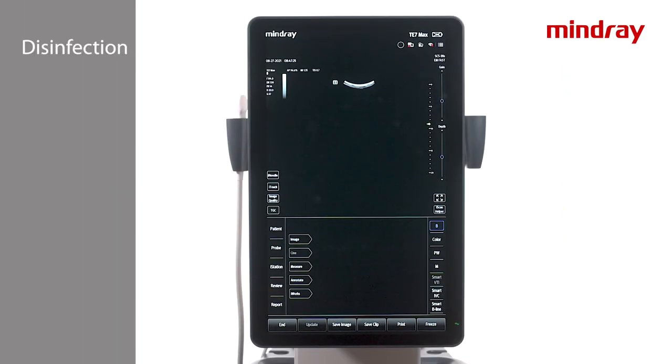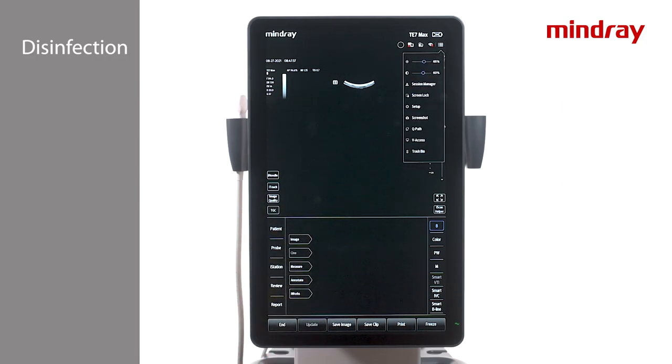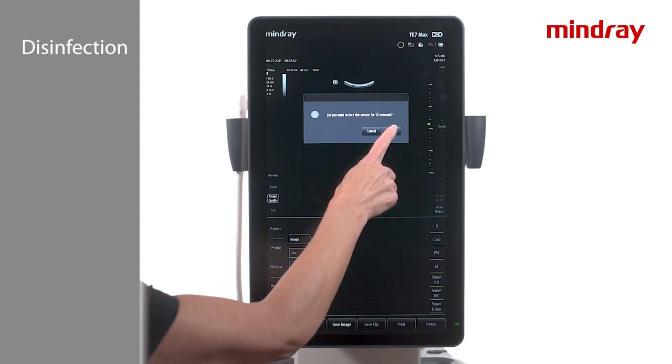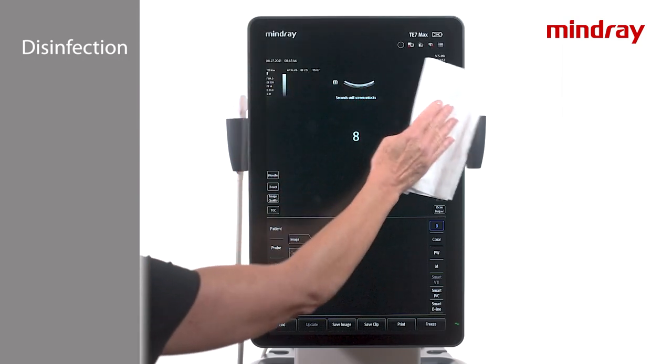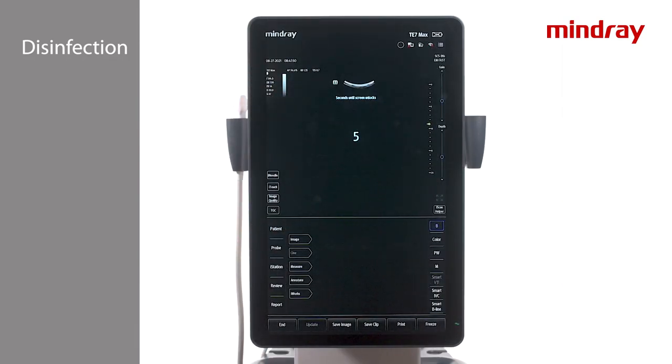The TE7 screen is easily cleaned and disinfected using an approved product. To clean the screen without changing any imaging parameters, select the menu button in the top right corner of the imaging screen. Select Screen Lock. This will lock the screen for 10 seconds in order to clean the screen without accidentally changing any settings. Please reference the provided disinfection and sterilization guide or contact an application specialist with any questions concerning system disinfection.